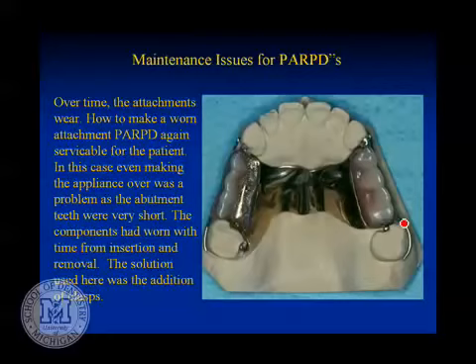Well, what had happened, as you can see, is this happens to be a cast gold base. Over time, the patient's lower teeth wore against the acrylic of the upper replacement teeth, eventually wore the acrylic away, and then bottomed out and finally stopped when they got to the framework. So can people get a picture in their mind that if you take the partial out and ask the patient to bite together without it, the lower teeth are almost in contact with the upper ridge? You have very, very little inner arch space.